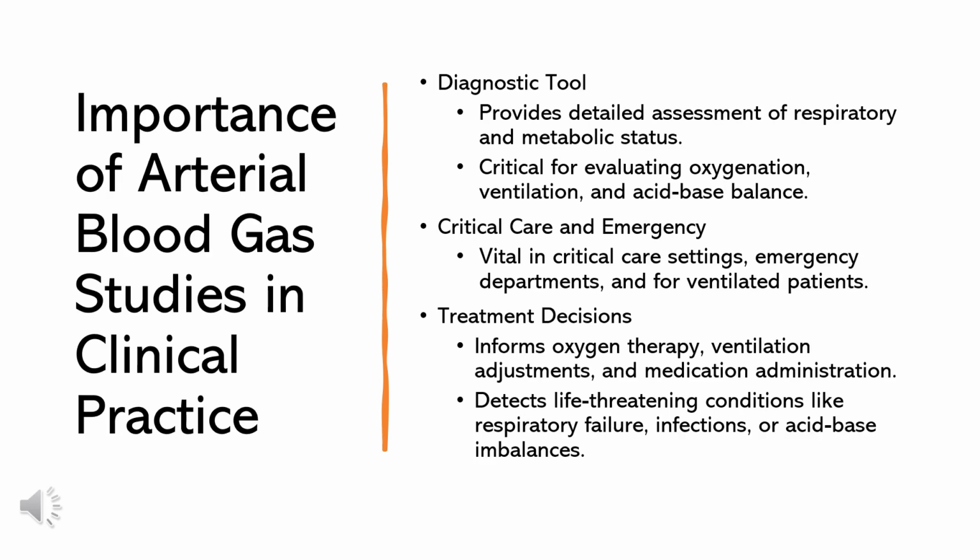Arterial blood gas, or ABG studies, serve as a vital diagnostic tool in healthcare settings, providing a detailed snapshot of a patient's respiratory and metabolic status. They are critical for evaluating oxygenation levels, ventilation efficacy, and acid base balance in the body. Their importance escalates in critical care settings, emergency departments, and for patients on mechanical ventilation.